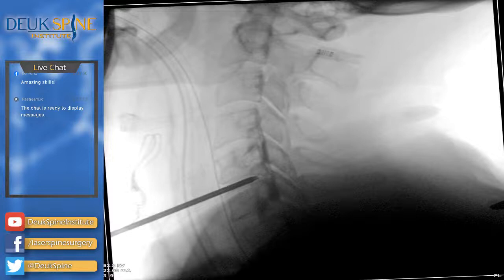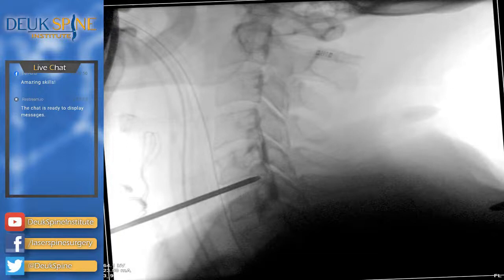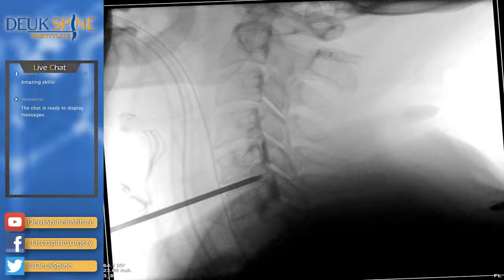Whatever you did. All right, so we're just about to the back of the disc. Need to go a little further. I want to get right in the herniation, right in the tear. That's right about there. Okay, everybody agree with the right disc before we do this? 5, 6, that's what we're consented for. That's what our surgical plan was. So we just want to make absolutely sure.